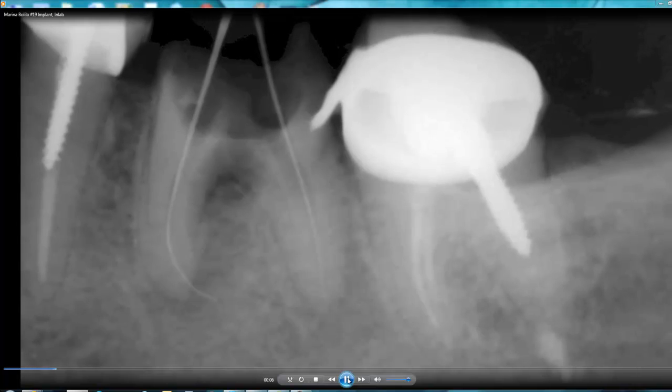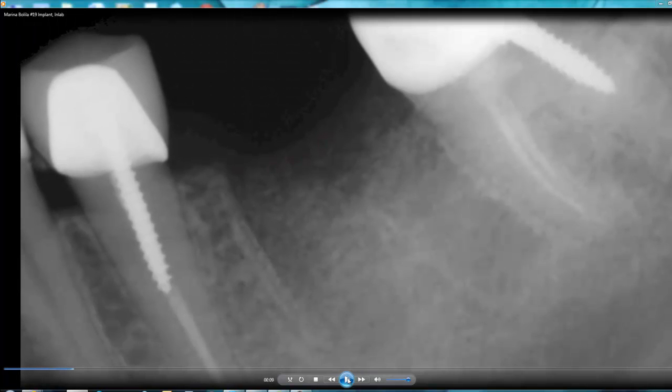When we extracted the tooth, we performed a site preservation technique. I used a cancellous bone graft material by ACE, sized 0.25 by 0.5 mm. We placed a collagen tape on top of the socket, put in the stitches, and waited three months until the area integrated. Another sign to confirm readiness for implant placement is to make sure the lamina dura disappears when the bone integrates.